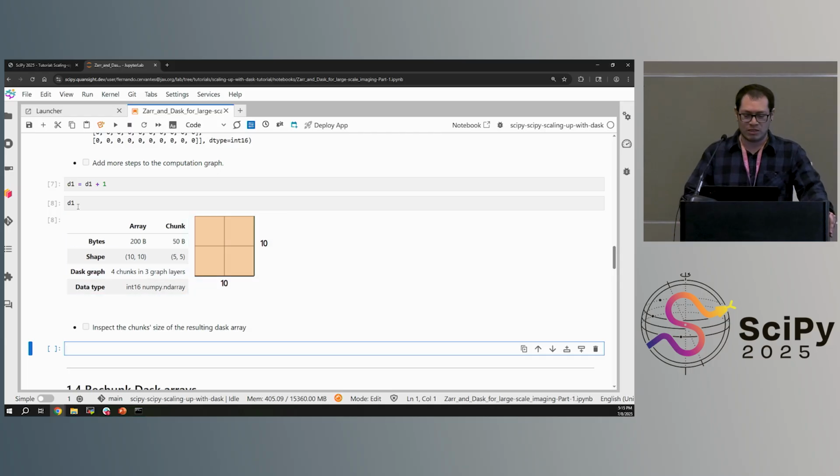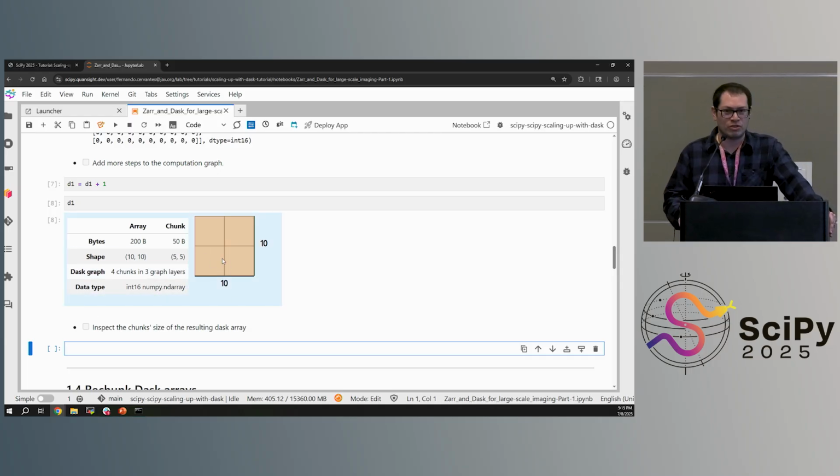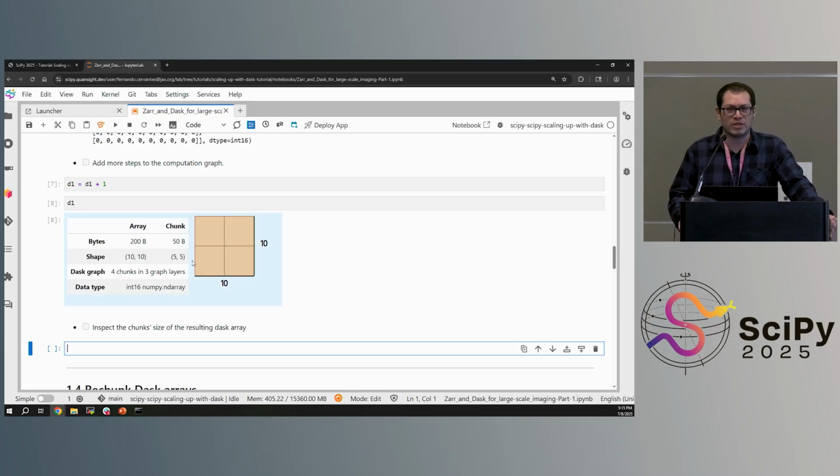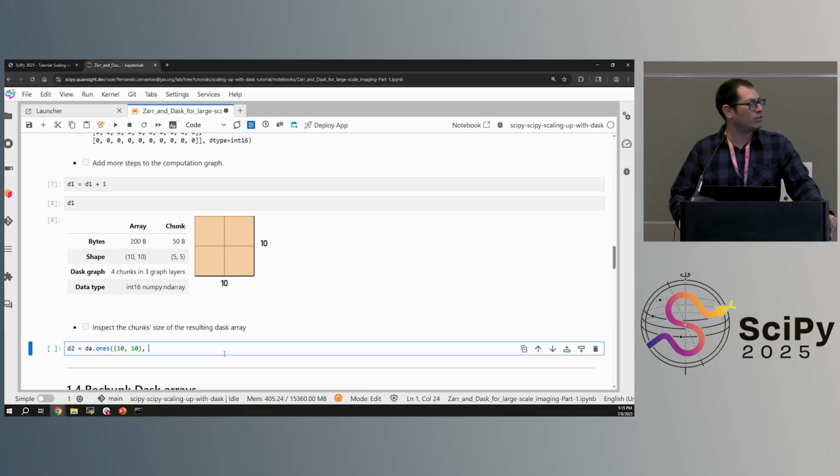Of course, there is an issue related to the memory on your GPU. If you want to move your whole image, it must fit in your GPU memory, something that, for now, is probably not possible for these kinds of images. We can think that these images are huge. I'm thinking of this specific image modality, the whole slide image. Those are basically microscopy images that tend to be tens of thousands of pixels per side, depending on the magnification of the microscope. So it can double that if you have more magnification on your instrument. And this is just a 2D image with 3 channels.